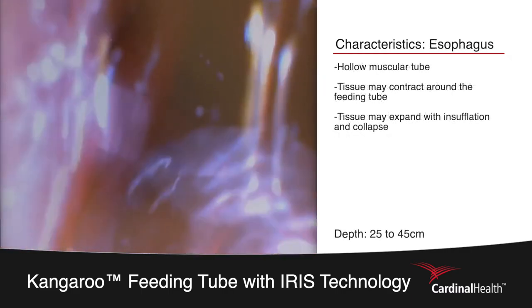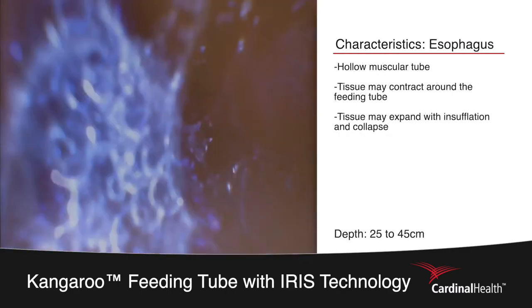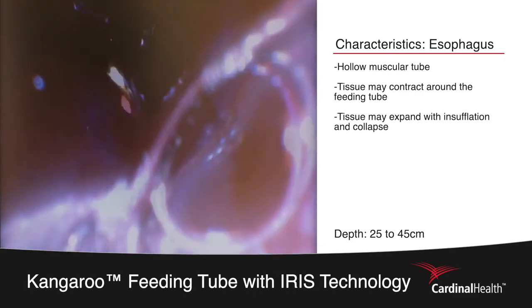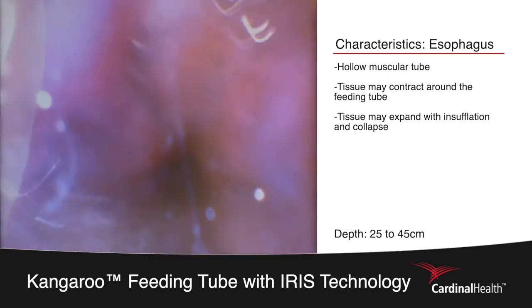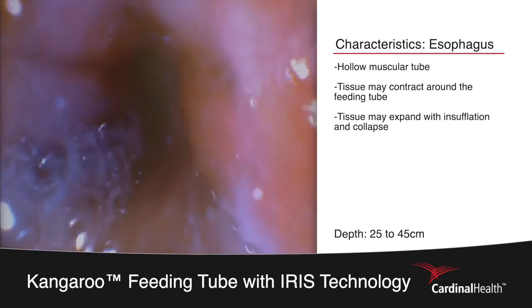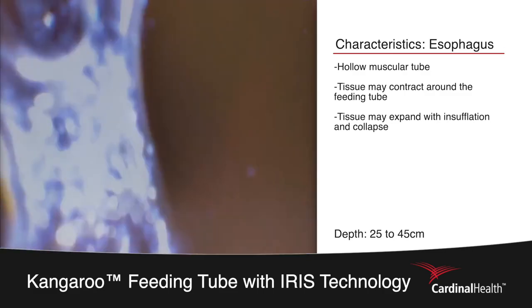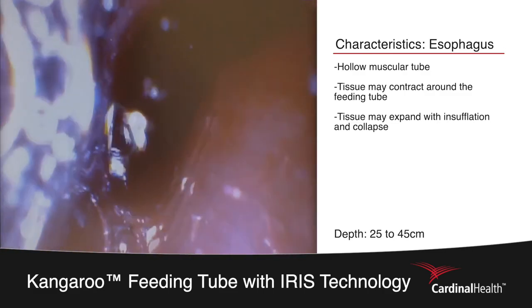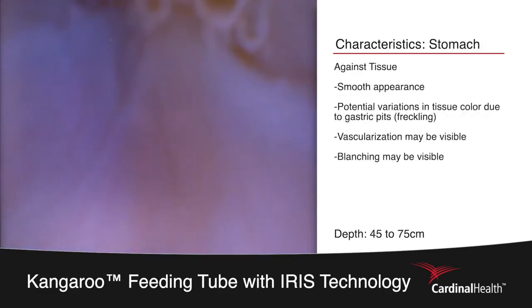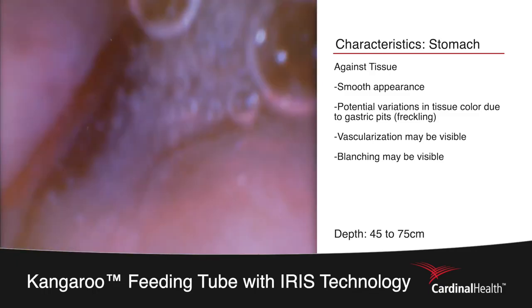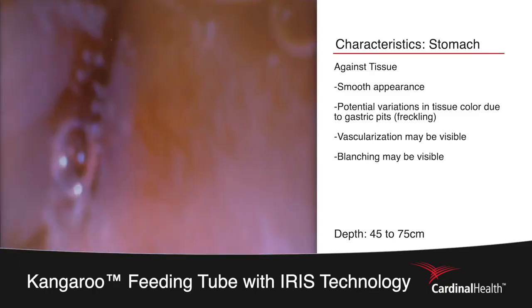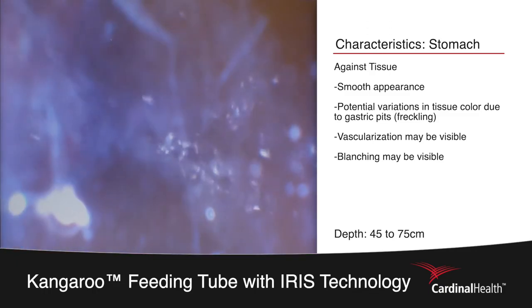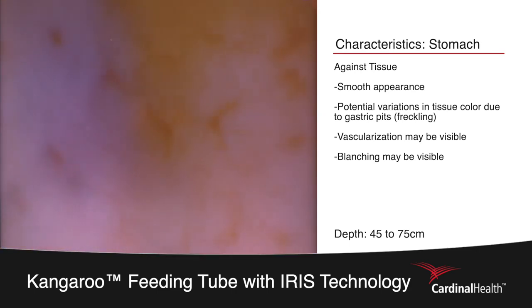In an attempt to reposition the tube, the placer has retracted the tube back into the esophagus, where we can see the lower esophageal sphincter. You can also visualize the esophagus collapse around the tip of the feeding tube before we progress back down into the stomach. The placer has entered back into the stomach as can be seen by the freckling appearance of the gastric pits.